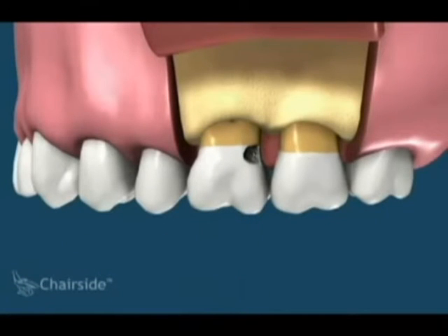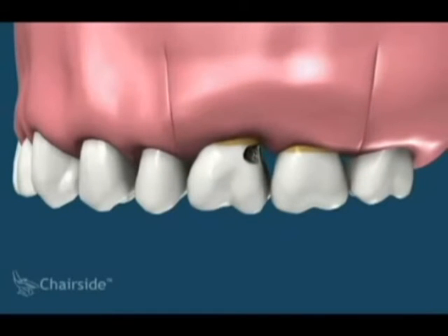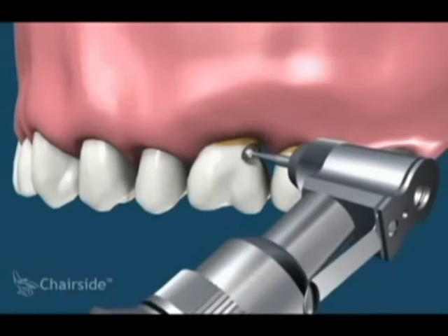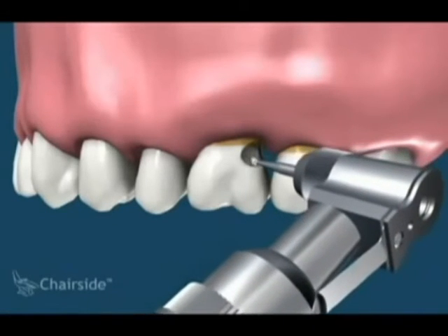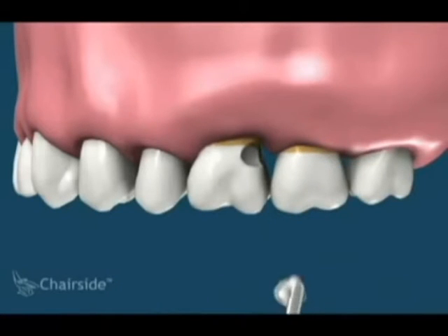The gums are then repositioned on the prepared bone, which now supports the gums below the cavity. The cavity can now be accessed. In this situation, a resin filling is used to restore the cavity. The cavity is accessible and removed, followed by the resin placement.